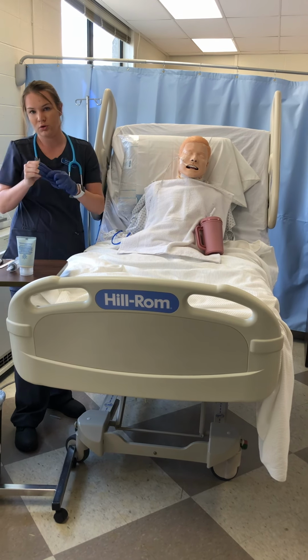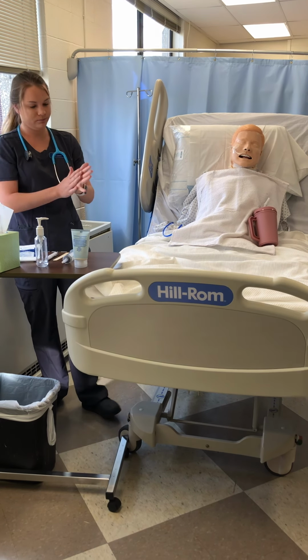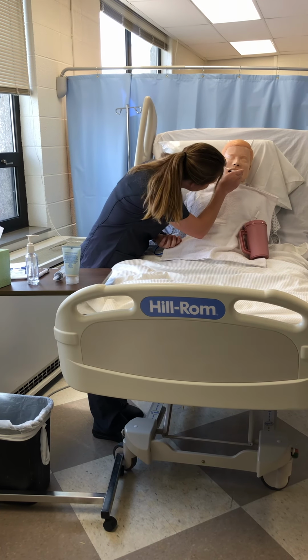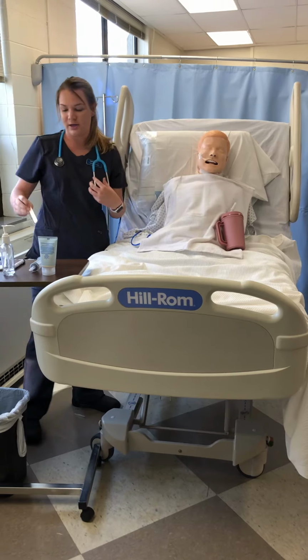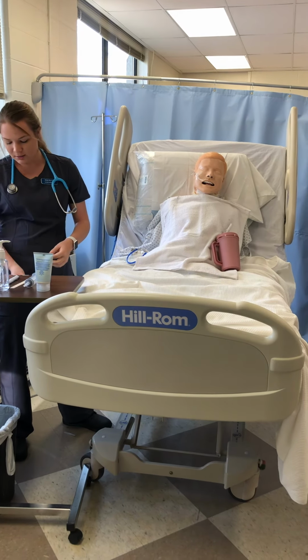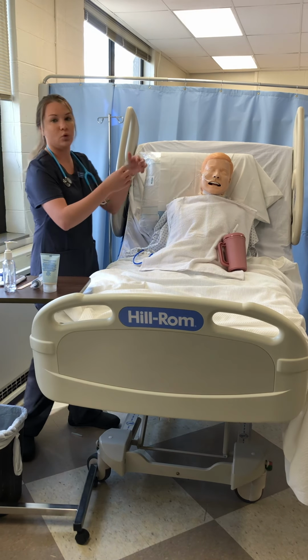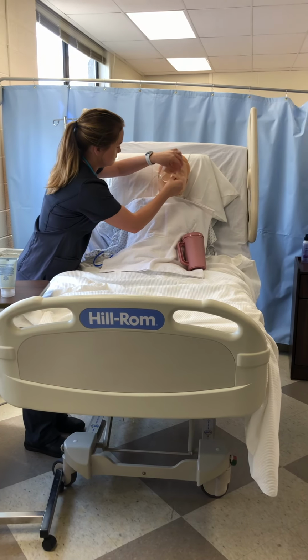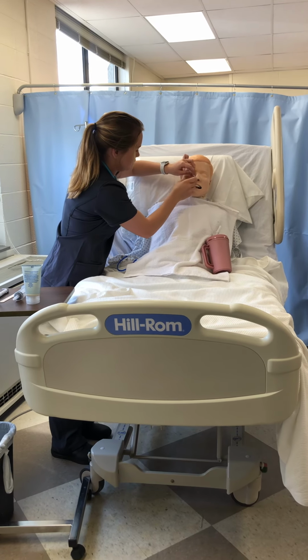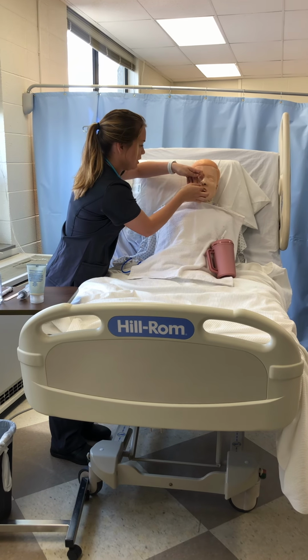I'm going to do this. Do some hand hygiene. And I'm also going to check and make sure the tube is not in the back of the mouth before I check placement. And I'm going to tape this to the bridge of his nose. If his nose was oily or anything, I would wipe it off beforehand. Putting it on the bridge of the nose and then wrapping it around.